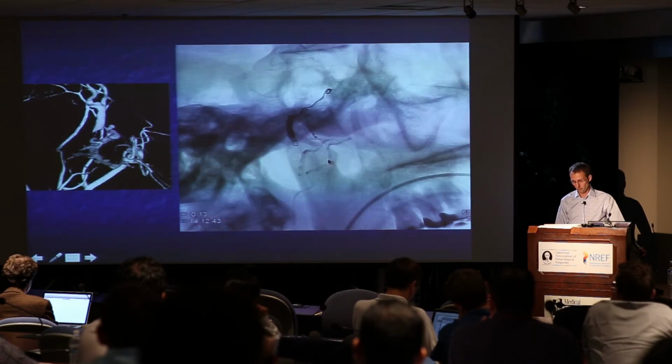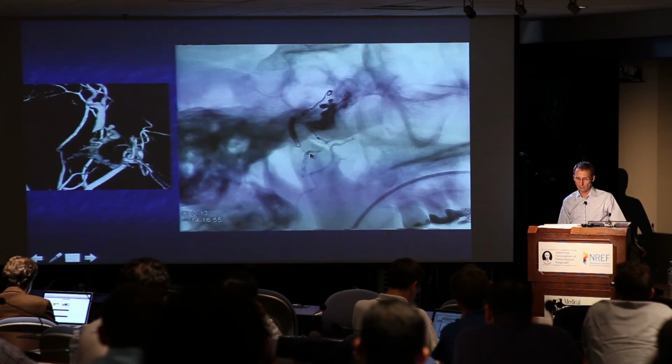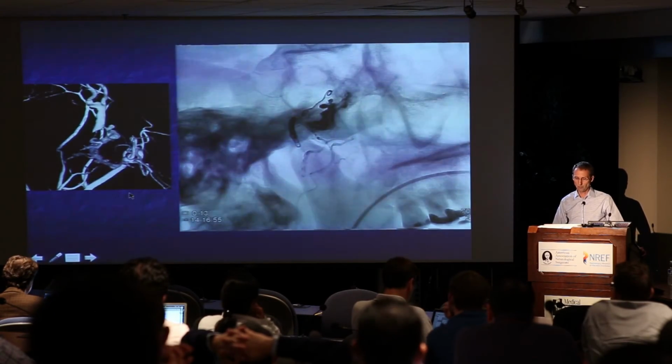I'm just going to show some selective images from this. The tip of our catheter is about here. We've had some reflux that we had to be patient to allow. Ultimately, we were able to get this going forward into the fistula pouch. You can see the different septations here that correlate with the fistula pouch. We thought we had done pretty well at this point.